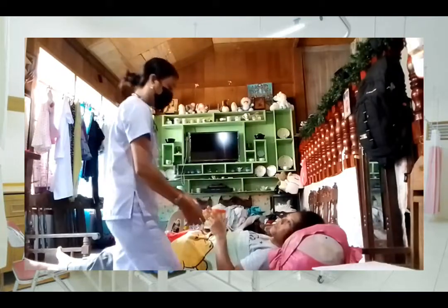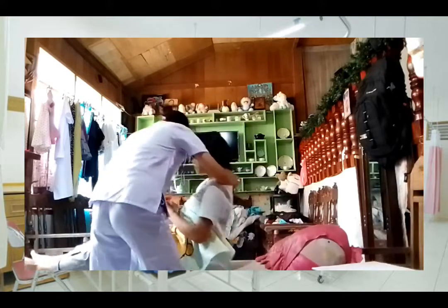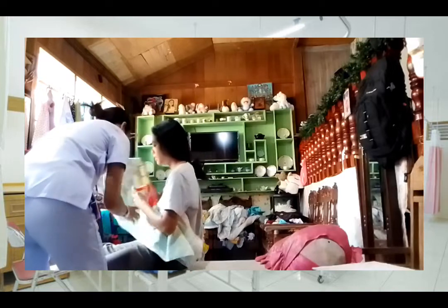Label the specimen completely and accurately. Clean the bedpan, discard gloves, wash hands, and send the specimen to the appropriate laboratory.